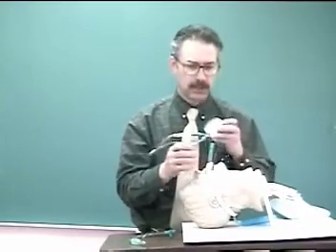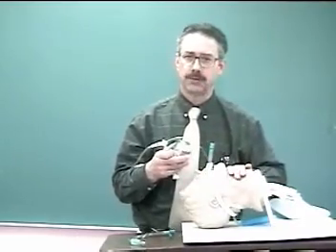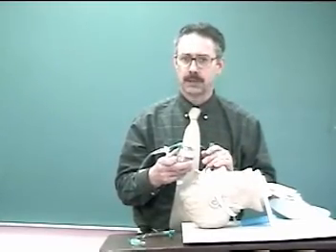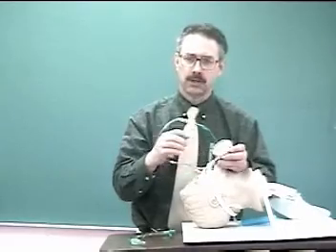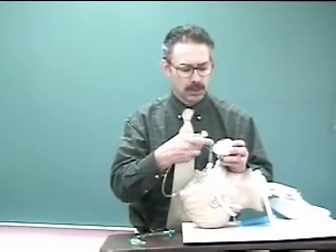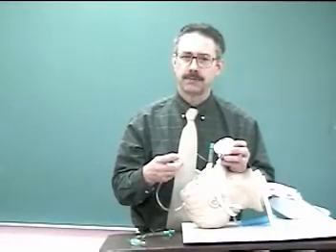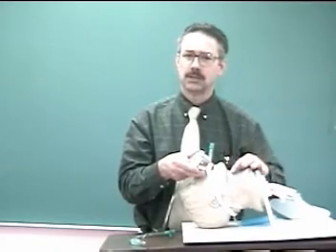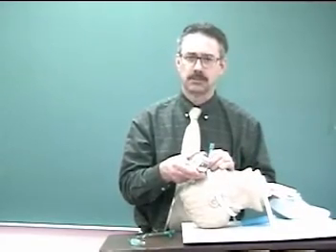We also take a listen with a stethoscope on the trachea to make sure we're not leaking air on each mechanical breath. If there is a leak, we inject a little bit of volume and check the pressure of the cuff, making sure that we use as little pressure as possible to fill the cuff of the endotube to seal off any leaks.